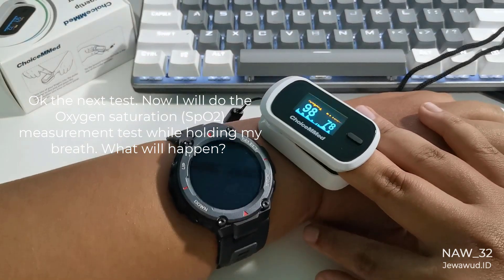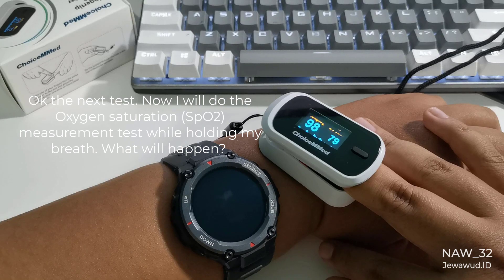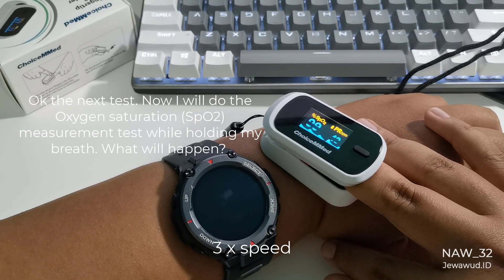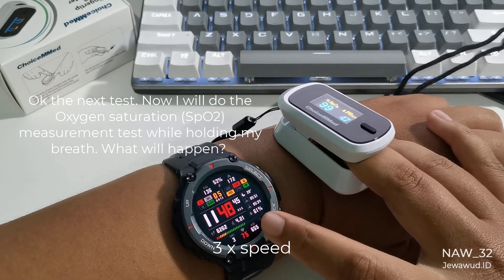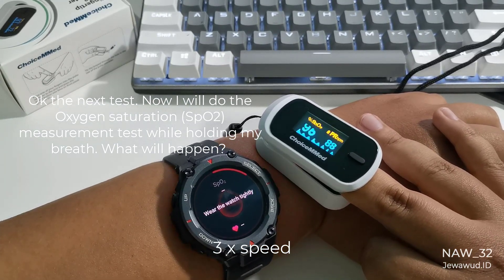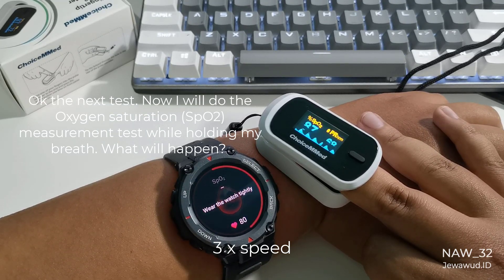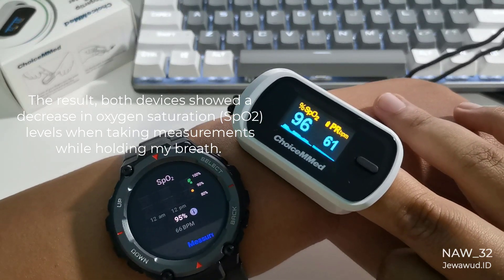Now I will do the oxygen saturation, SpO2, measurement test while holding my breath — what will happen? The result: both devices showed a decrease in oxygen saturation SpO2 levels when taking measurements while holding my breath.